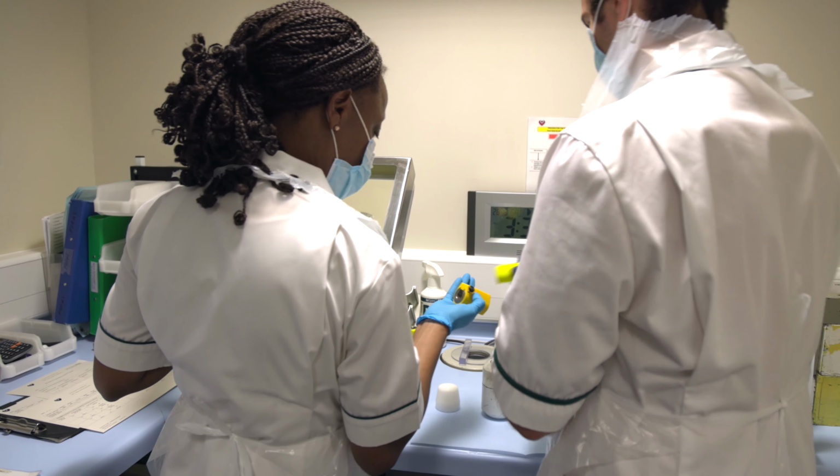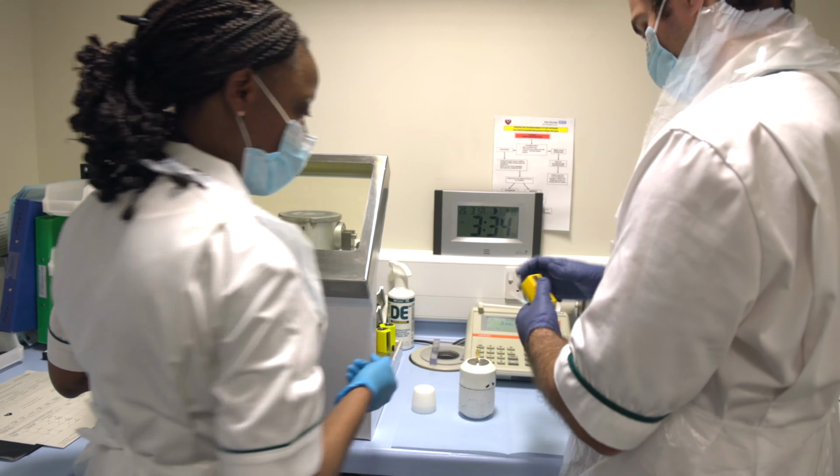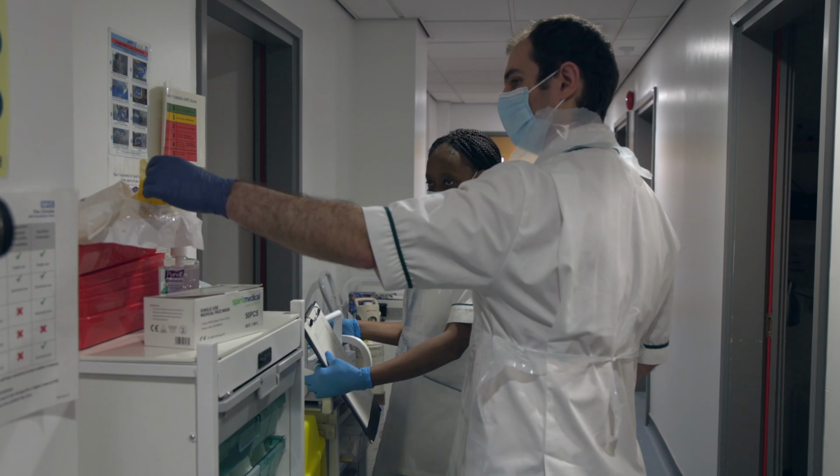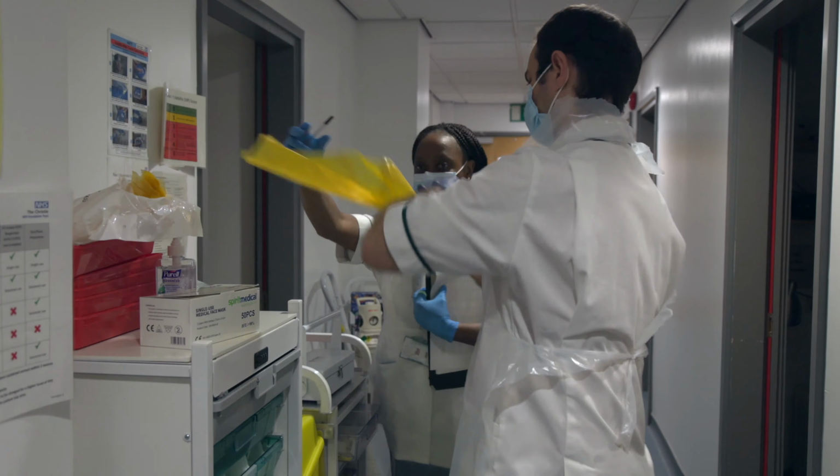When we perform a PET scan, we give the patient what we call a radiopharmaceutical. This is a chemical that we've intentionally made radioactive that will be transported around the body in a way that will tell us something about how the patient's body is working. We then measure the radiation that comes out of this molecule to see where the chemical's gone. There are lots of different radiopharmaceuticals that we use in PET, but today I'm going to be talking about FDG.